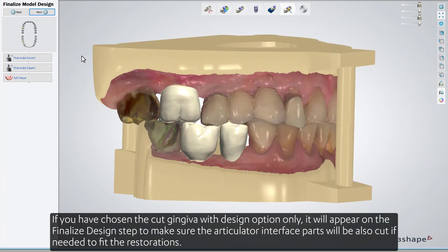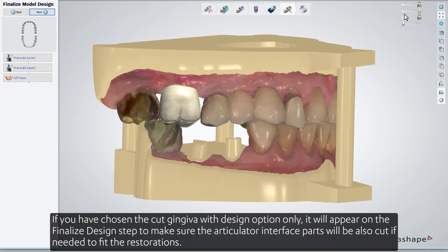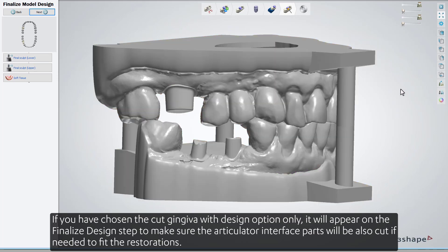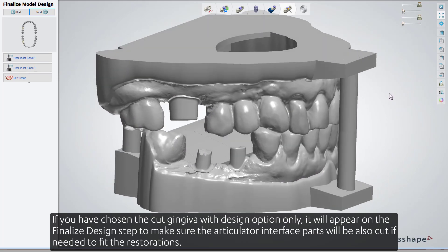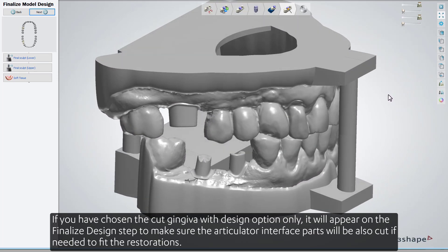If you have chosen the 'Cut Gingiva with Design' option only, it will appear on the finalized design step to make sure the articulator interface parts will also be cut if needed to fit the restoration.